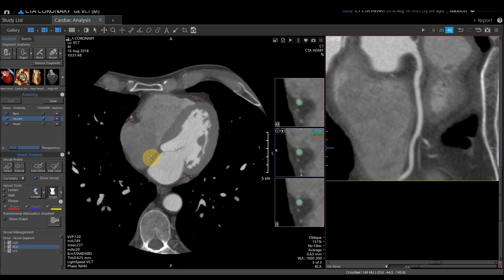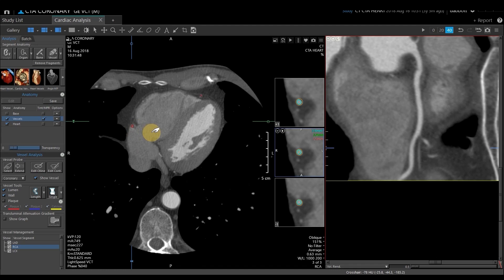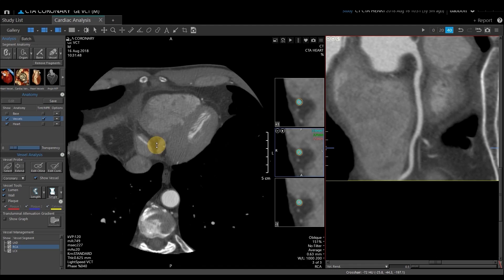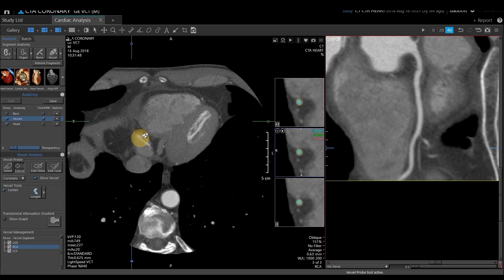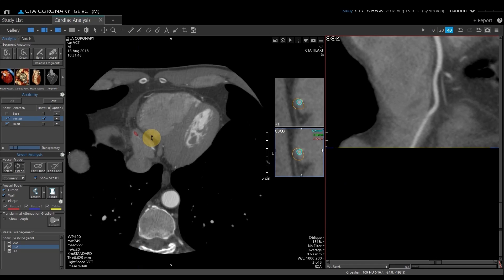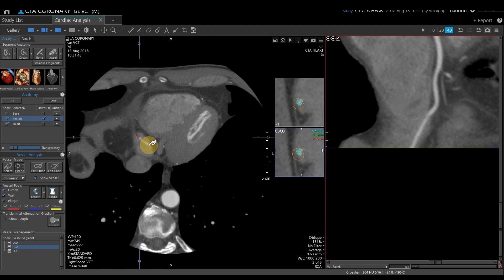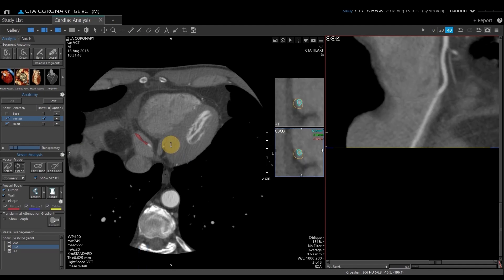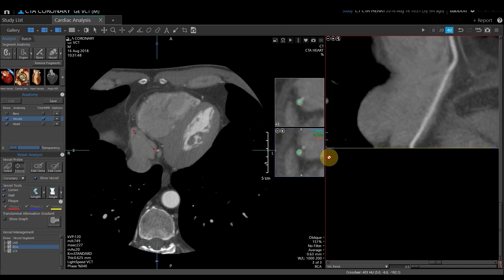I can scroll through, follow my RCA, and see it kind of stops right here in the middle. If I would like to extend that vessel, under Vessel Analysis there is a button labeled Extend. I'm going to select that and click on my 2D image where I would like it to extend to. If you notice, the color has changed — so that has been added. I can continue to follow that down and add on to that vessel as needed.